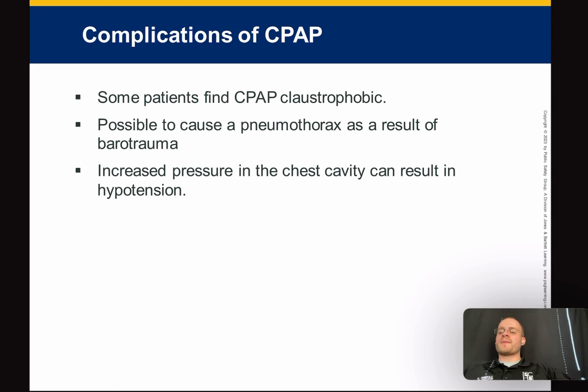You got to be aware that if a patient's already anxious and having a hard time breathing, it's a hard sell to put this on someone's face and strap it to them. And they lose, for the most part, their ability to speak and communicate to you because it's muffled with all the oxygen and the mask. And so that's one thing. The other thing you have to worry about is claustrophobia. And so what I like to do is ask the patient, do you sleep with a mask, right? And if they do, then they're used to CPAP. I'm like, great, I'm going to put one of those on you, okay? And so they already know, right? And I've actually had patients come in, they're like, I need CPAP, right? And they already know they're about to get the mask.